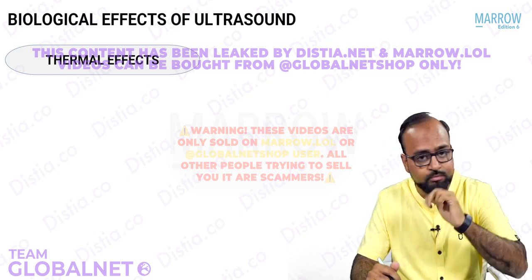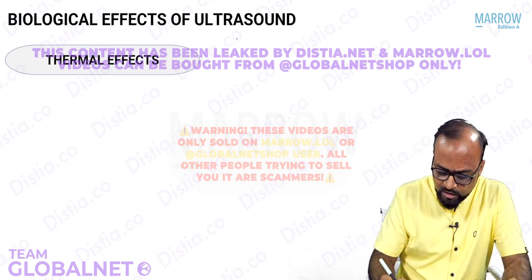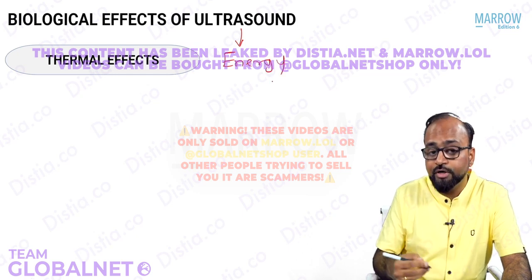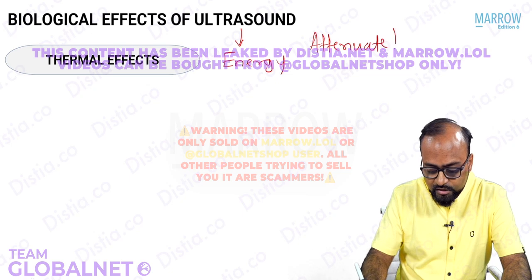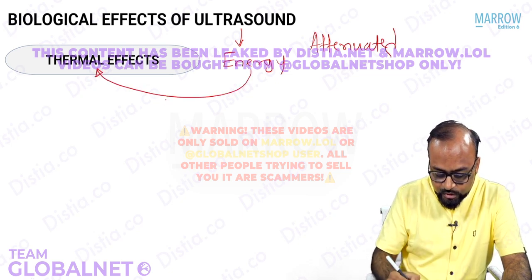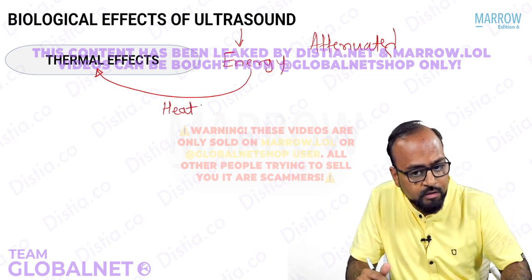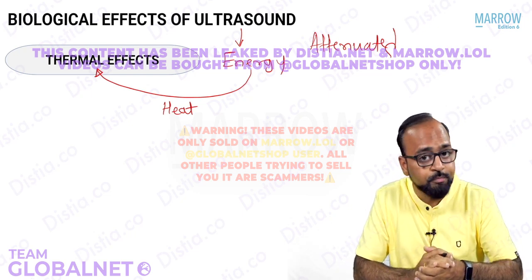Yes, it has two types of effects. One is called thermal effects. What are thermal effects? See, the ultrasound beam is going to carry some amount of energy. That energy is going to get deposited into the body. When the ultrasound beam is blocked or attenuated, that energy will be deposited into the body and converted into heat. So that is what is going to create the thermal effects, right? Now this is more in Doppler because more energy is used. It may produce tissue heating.